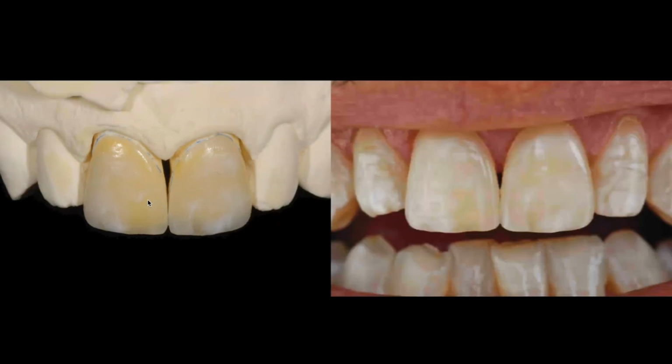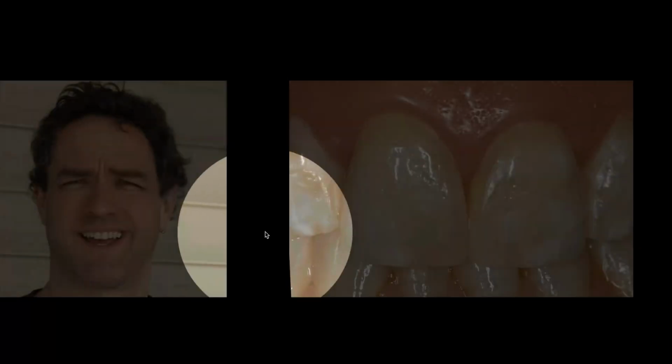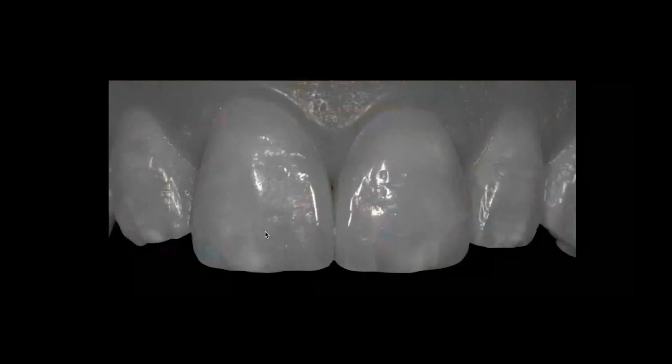I'm really getting my blend from the restoration more in how it harmonizes with the adjacent teeth. It's more about getting that same light reflection, the same topography, and same little details. And I softened up a little bit on the white calcification to try to make them stand out a little bit more. But if you look at it in black and white, I think you can kind of see what I mean. What really makes this flow and makes this work for a case that's got to be at least 15 years old is really the time that was spent here.